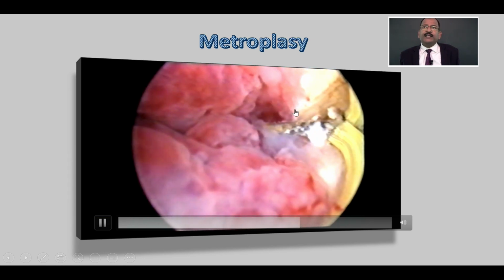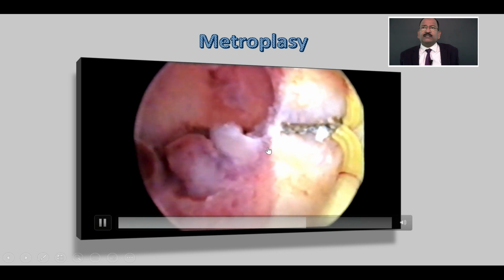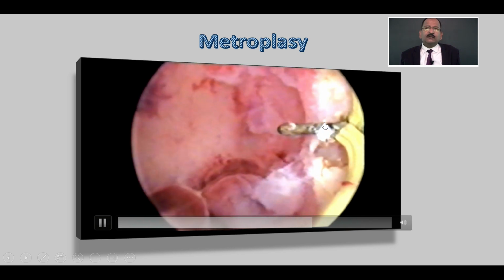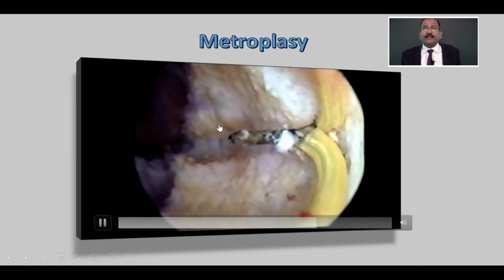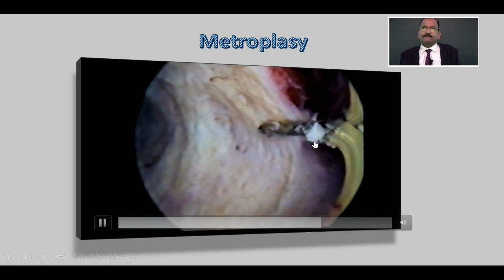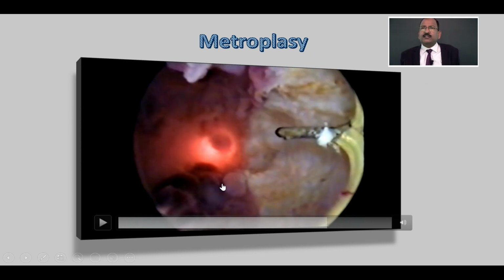Now we can see here the right side is almost over, and wait, this texture becomes still, then the right side is almost finished, just a little bit, that's all. But the left side of the septal wall is still there. So this is right, meaning patient's right, your left, but this side is still darker. So this we have to still cut. And meanwhile, again ask the assistant to push the telescope and see the trans-illumination.